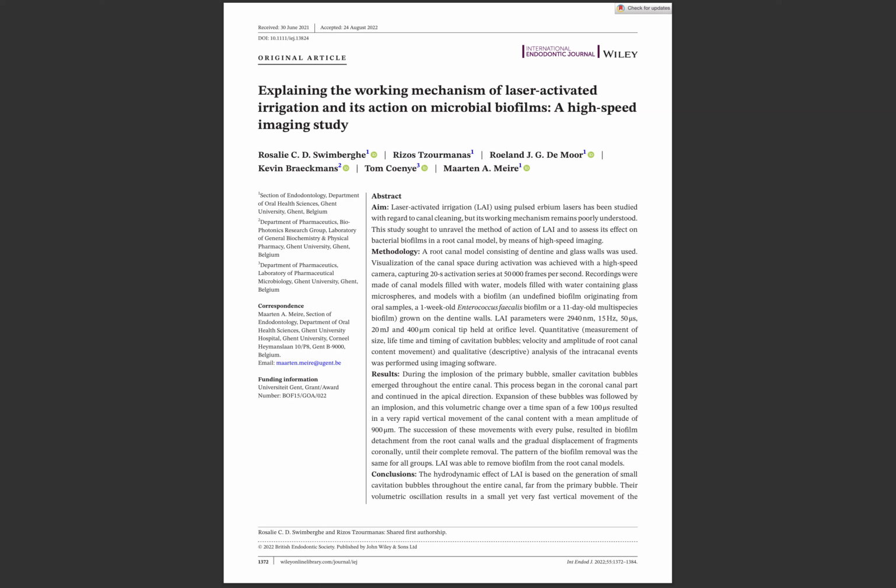So, to conclude, the hydrodynamic effect of laser activated irrigation is based on the generation of small cavitation bubbles through the entire canal, far from the primary bubble. Their volumetric oscillation resulted in smaller yet very fast vertical movement.